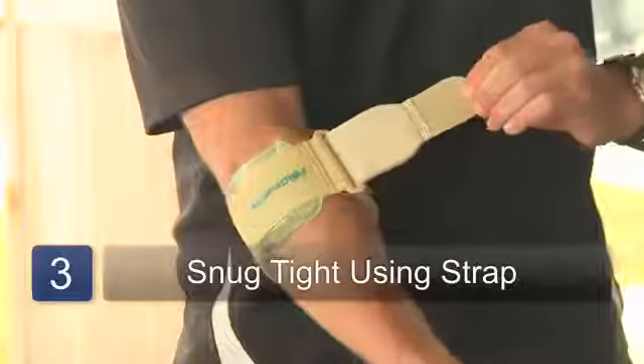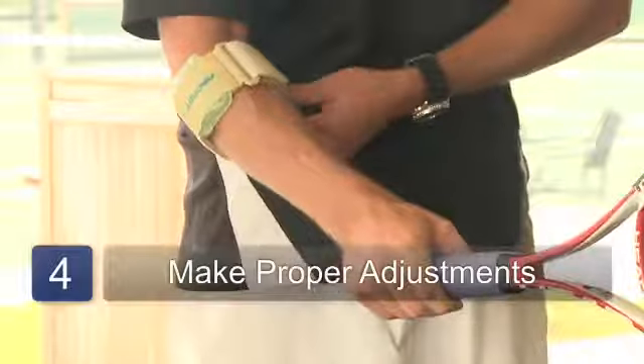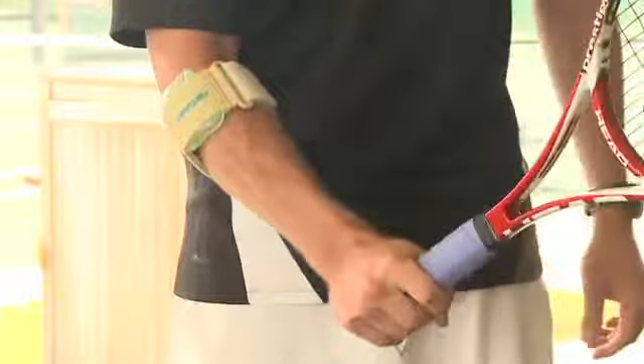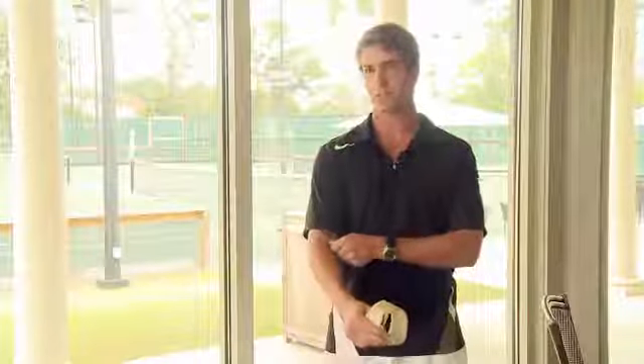Step three, you want to snug using the straps until it's tight on your arm. Step four, you want to make adjustments. A good rule of thumb is to make sure that you can get a good strong grip on your racket without it squeezing your arm too tight, and if it is too tight you just want to loosen it just a little bit.